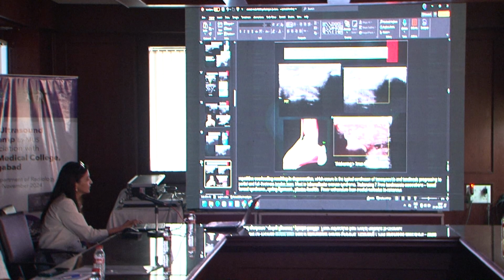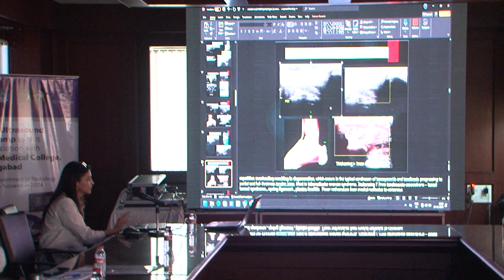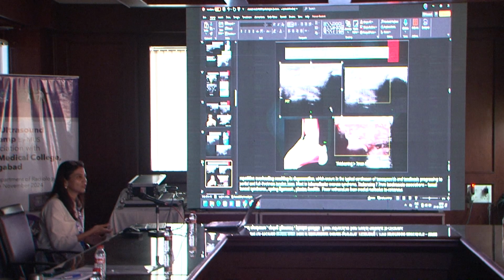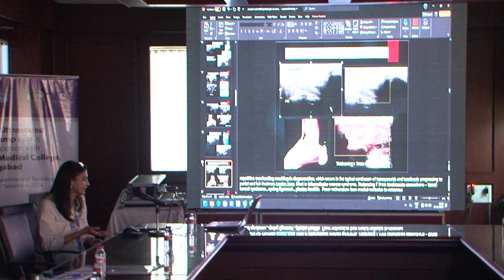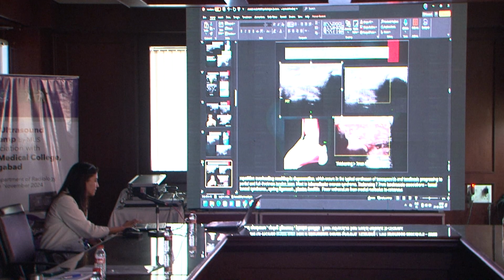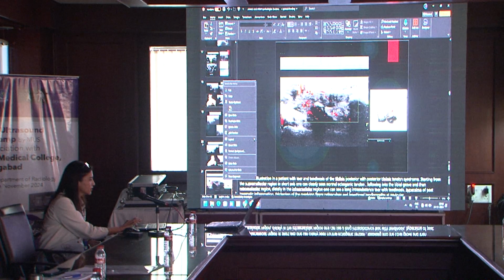What do we see here? That the tendon is thickened. We see subcutaneous edema. We also see there is a lot of vascularity. Tendon thickening more than 7 mm in tibialis posterior is usually tendinosis. So, this is a case of tendinosis. In any case of tibialis posterior dysfunction, you also have to look at the spring ligament, because it can cause a spring ligament injury and then flat foot, and also have a look at the flexor retinaculum. So, that is a case of tibialis posterior tendon syndrome.